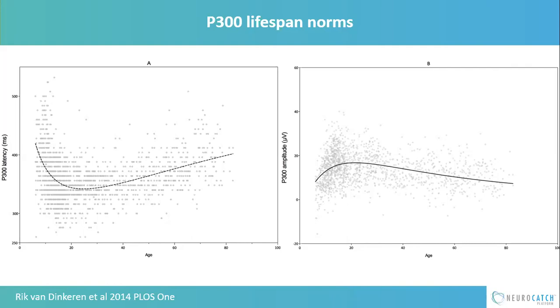In our labs for our students, they do experiments where they do pre and post caffeine, and the latency of the P300 changes. So please be aware that while there are norms, this component particularly is very specific to how the individual is on that day.